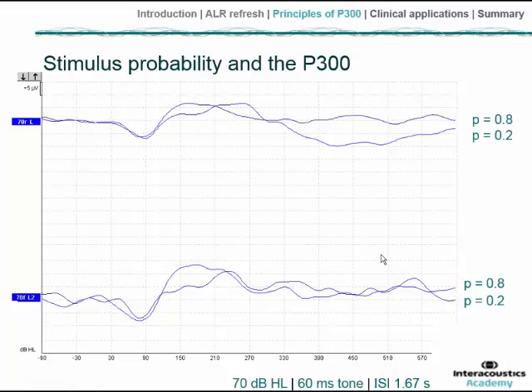We could take the discussion of probability to the opposite extreme by asking what would happen if we had an oddball paradigm where the subject was asked to attend to the frequently occurring sounds by counting them and ignoring the rare sounds. This slide helps us visualize this effect. The top two traces show a standard oddball paradigm with no particular attention asked of the listener.